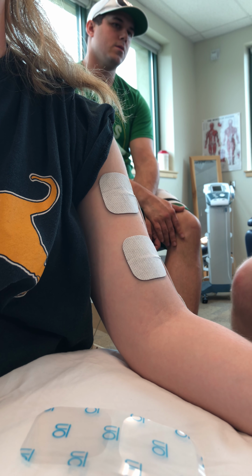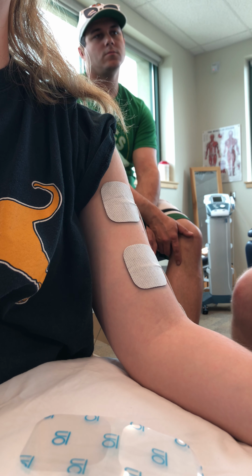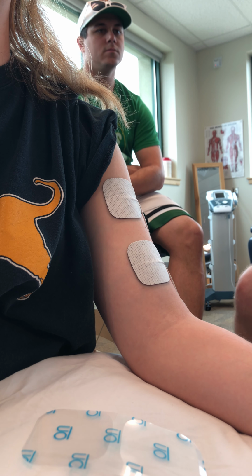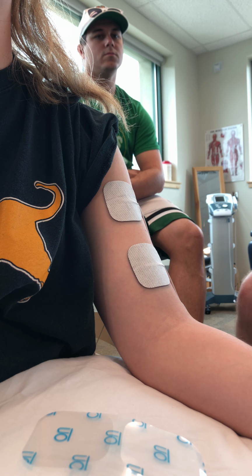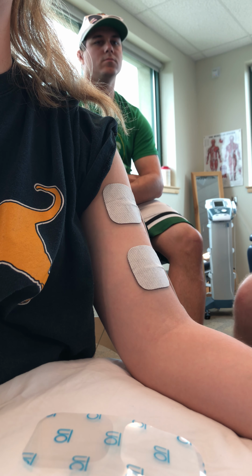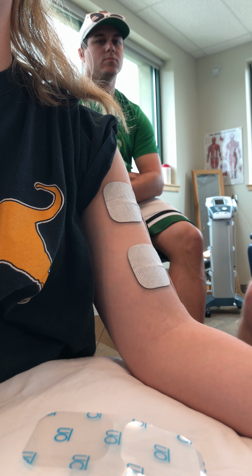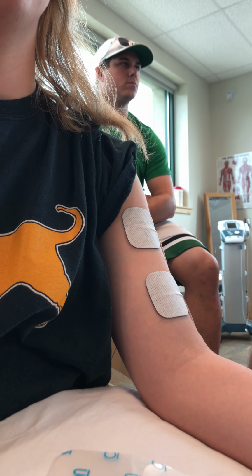So again, usually when you first start to do this and someone's really weak, you need more power by the machine. As they get stronger, less power on the machine, more on them. But the goal is you have to get at least a muscle contraction. If you can't increase the intensity so you can get a muscle contraction, then why are you doing this in the first place? Does that make sense to everyone? So you at least have to get the contraction. It's up to her if she wants to tolerate any more. Okay? All right, so that's it. Make the bicep dance.